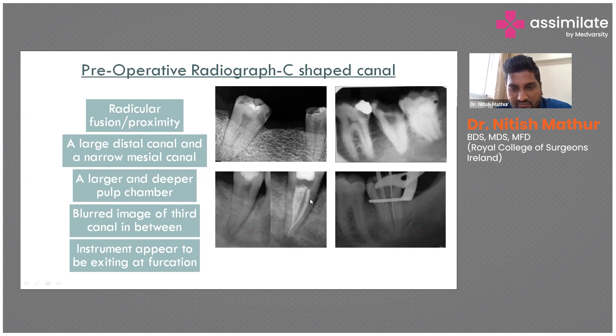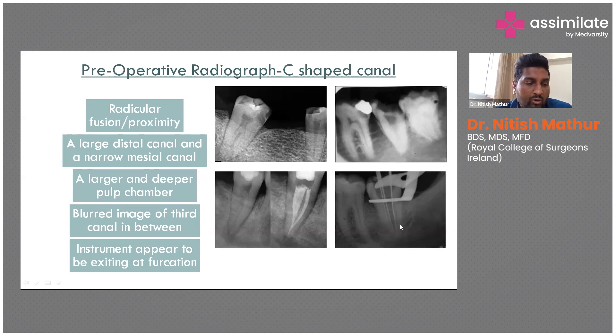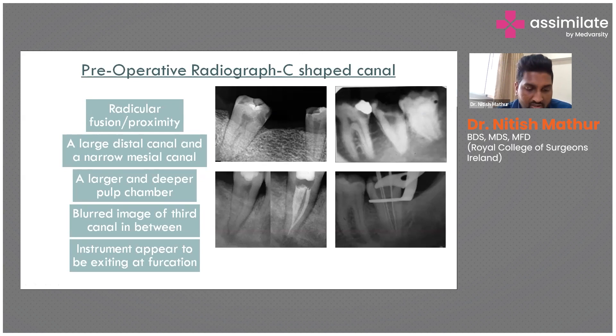Additionally, if an instrument is placed, it appears to be exiting at the furcation. All these features are suggestive of and help suspect a C-shaped canal.